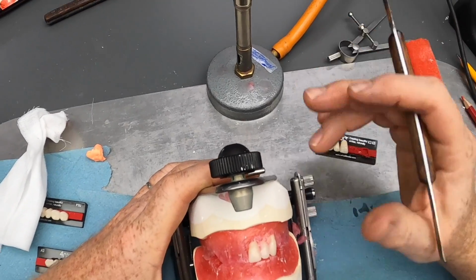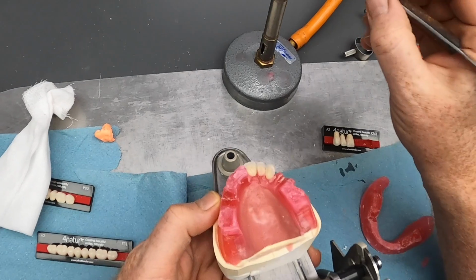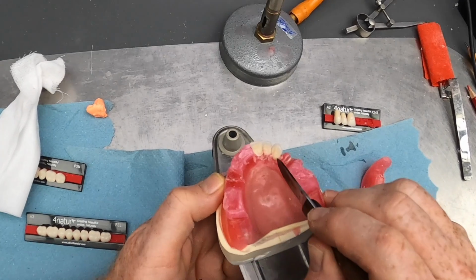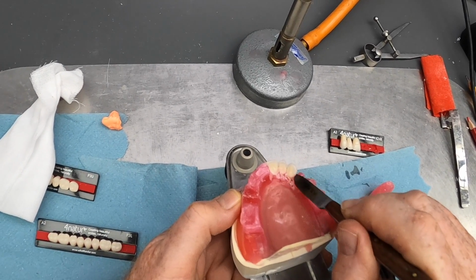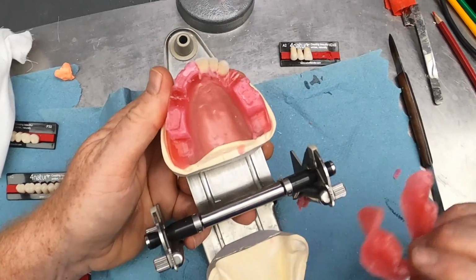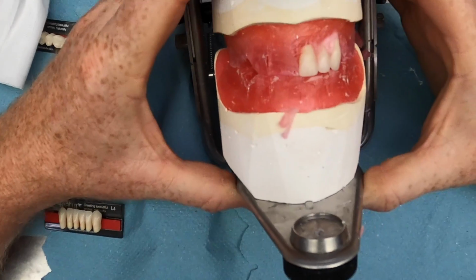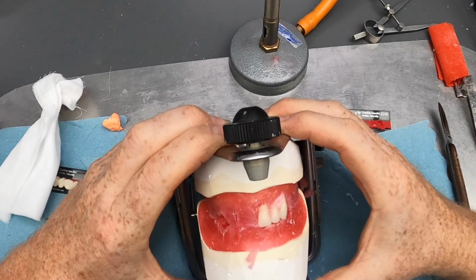As the wax contracts, sometimes you get small shifts in the position of the teeth, but we can just give them a tweak as necessary as we carry on. So just around the backs of those teeth again, the palatal aspect, just make sure that they stay in, and then we can repeat for the upper right. Okay, so I'm going to do that and I'll show you when I'm done.